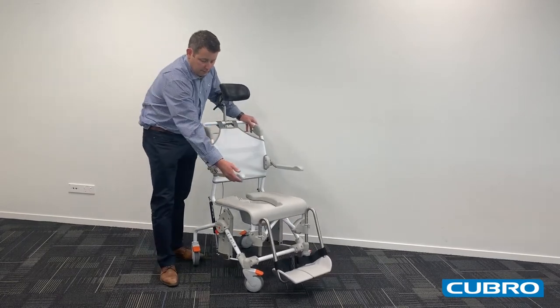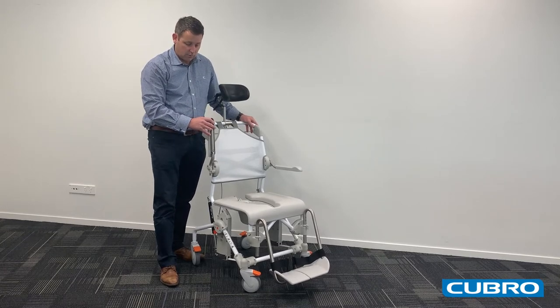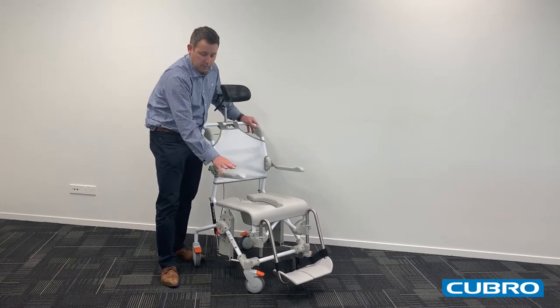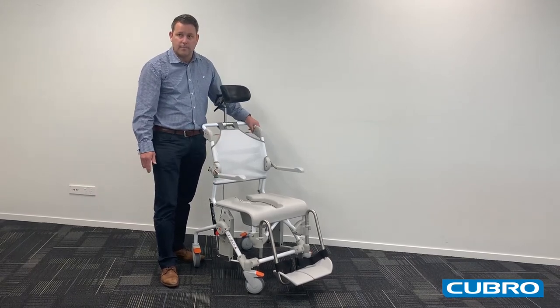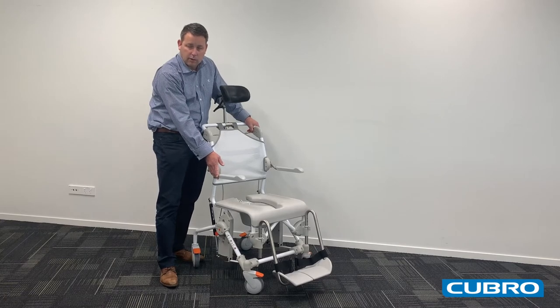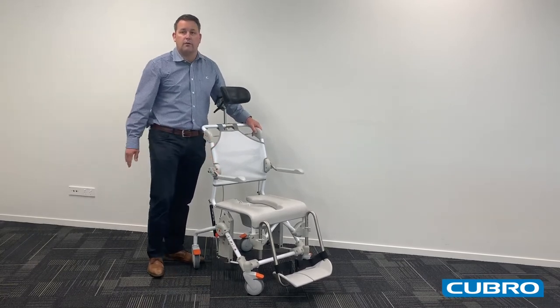The armrests lift up to provide access from a wheelchair or bed, and these armrests can be adjusted to increase or decrease the width of the chair, giving a between-the-arm measurement of 420mm to 540mm.